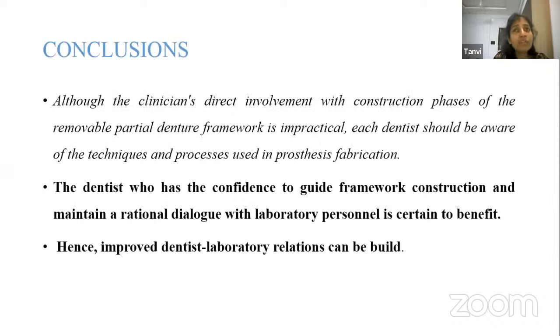So how these recent advances are different from the conventional technique which I have explained is, they are more precise, less time consuming, with fewer chances of errors, and in bulk, about 90 to 120 units can be constructed in one go by these recent advances.